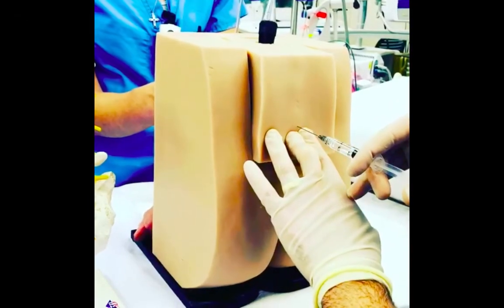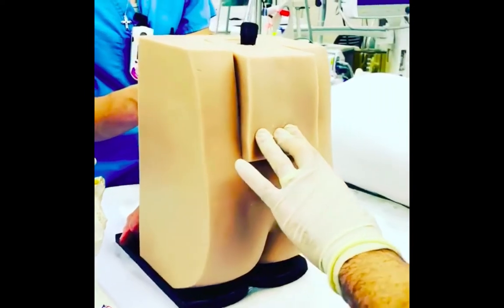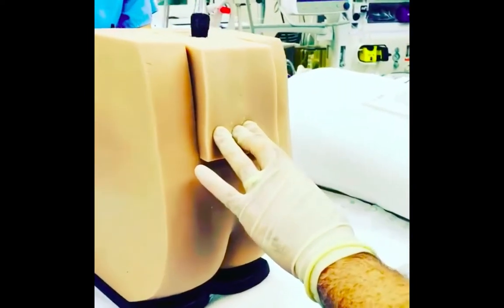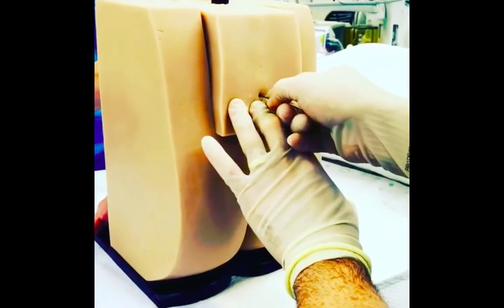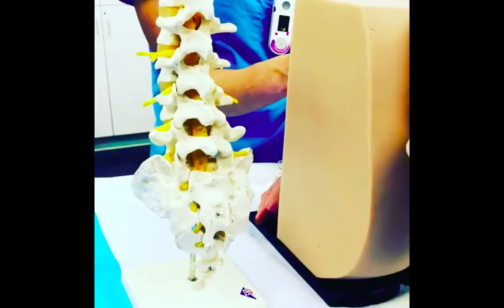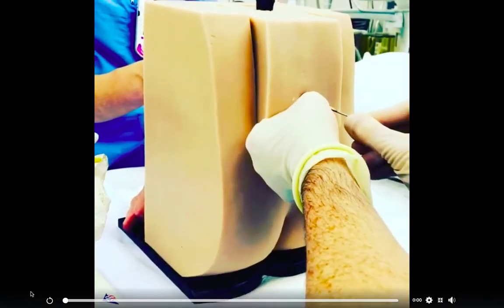Now you do want to make a nice skin wheel, make sure the patient doesn't feel the rest of that. You want to keep your fingers there because you've already identified midline, and you go in the same place a few centimeters above, and you want to introduce your needle until you feel some resistance.